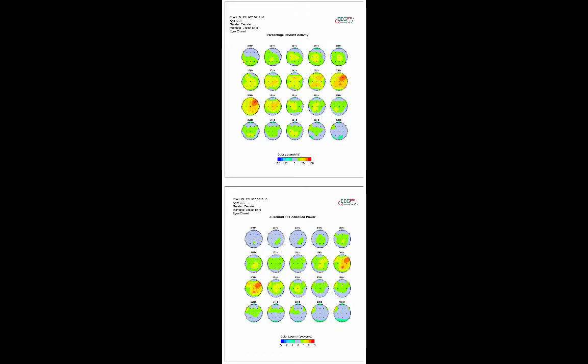This means that the deviant average z-score that can be seen in the same frequencies and electrode sites in the absolute power results is present in the EEG recording most of the time.